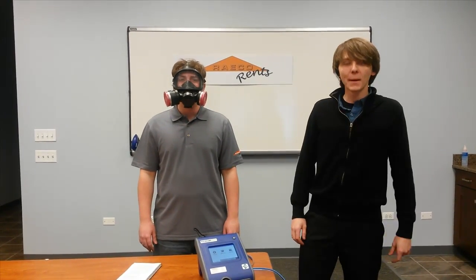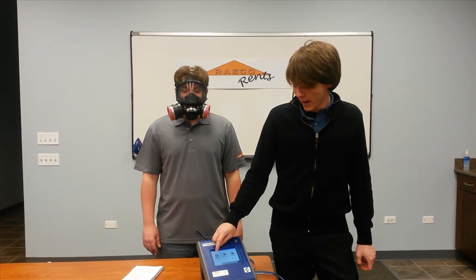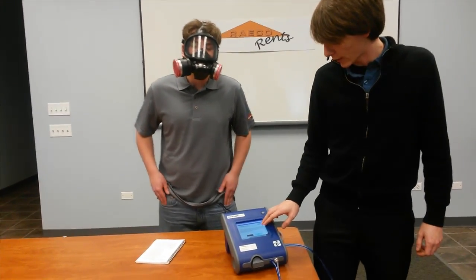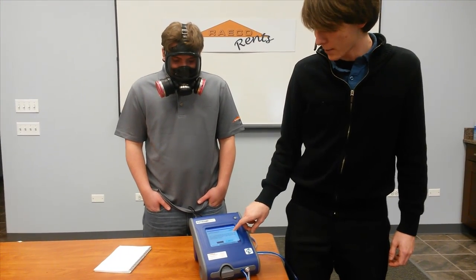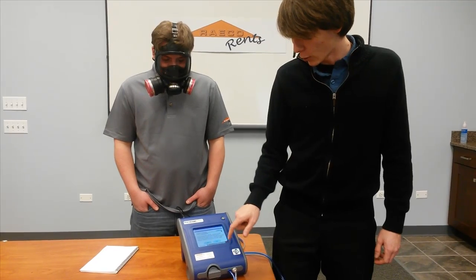Once you have your port account set up and you've passed your daily check, you're going to touch the Fit Test icon on the main screen. This is going to prompt you to select the database that you're going to save everything to. You'll just touch the drop down menu button, select your database, and press the load button.